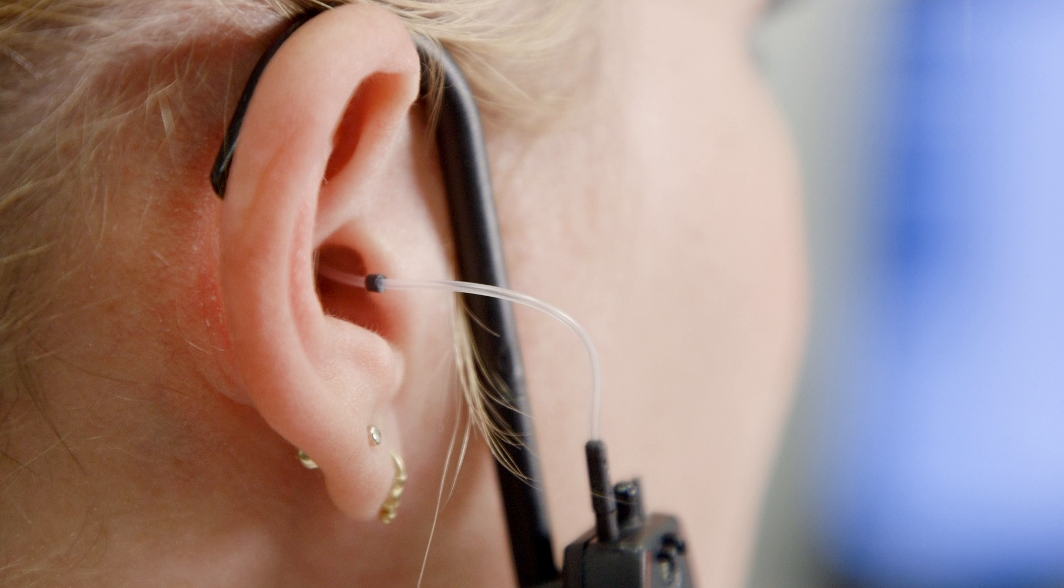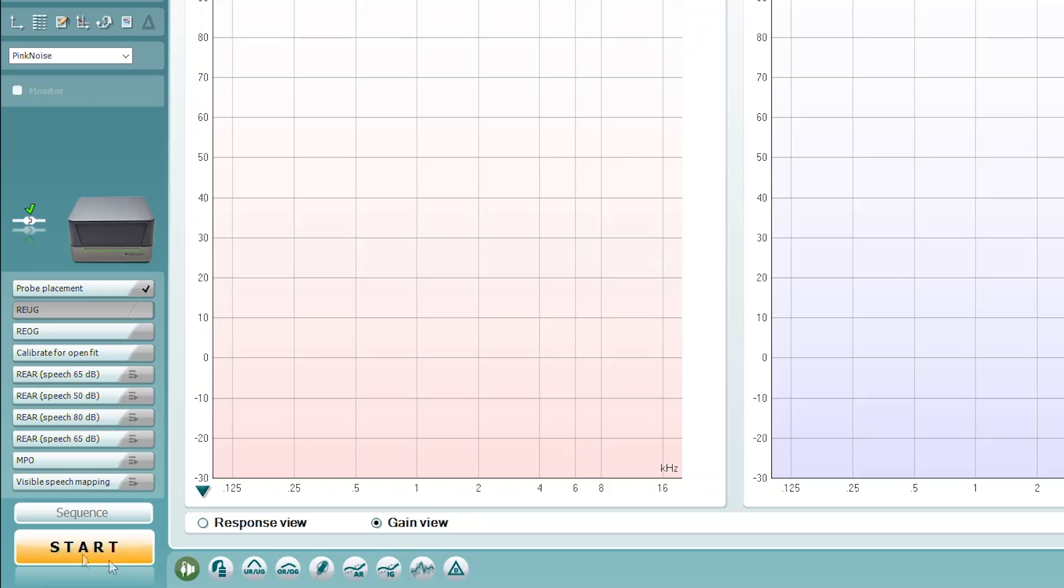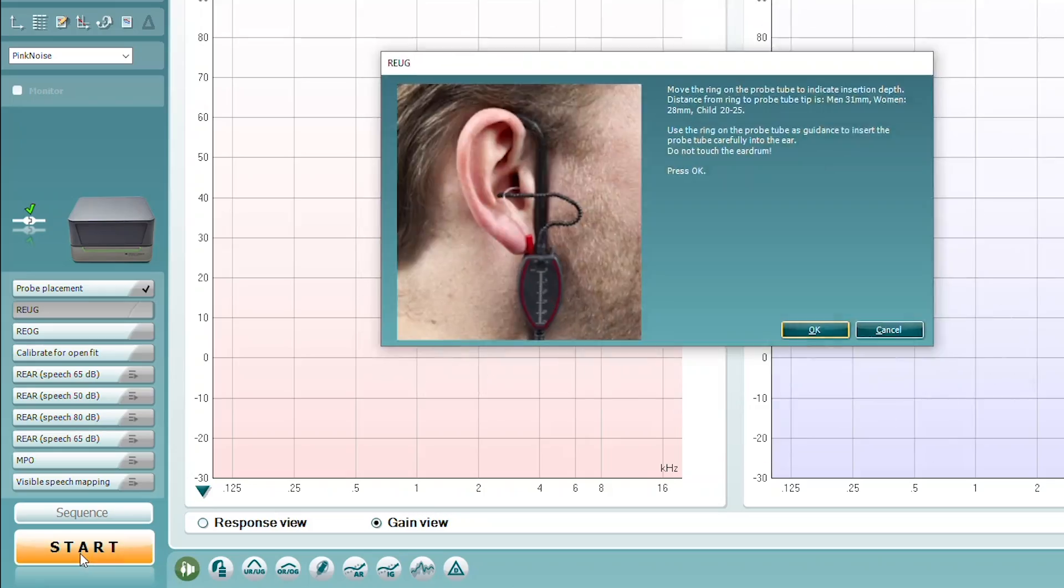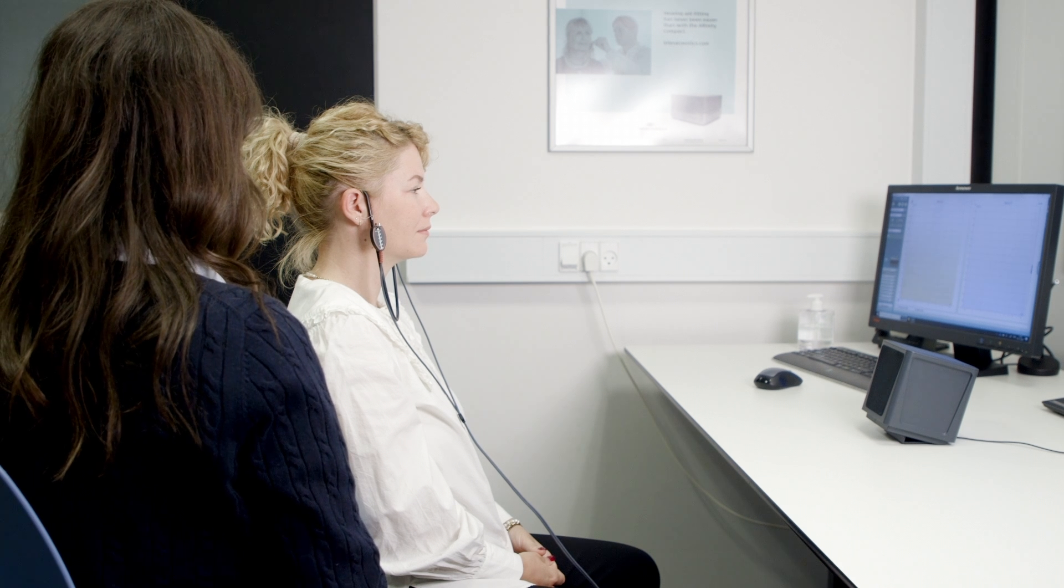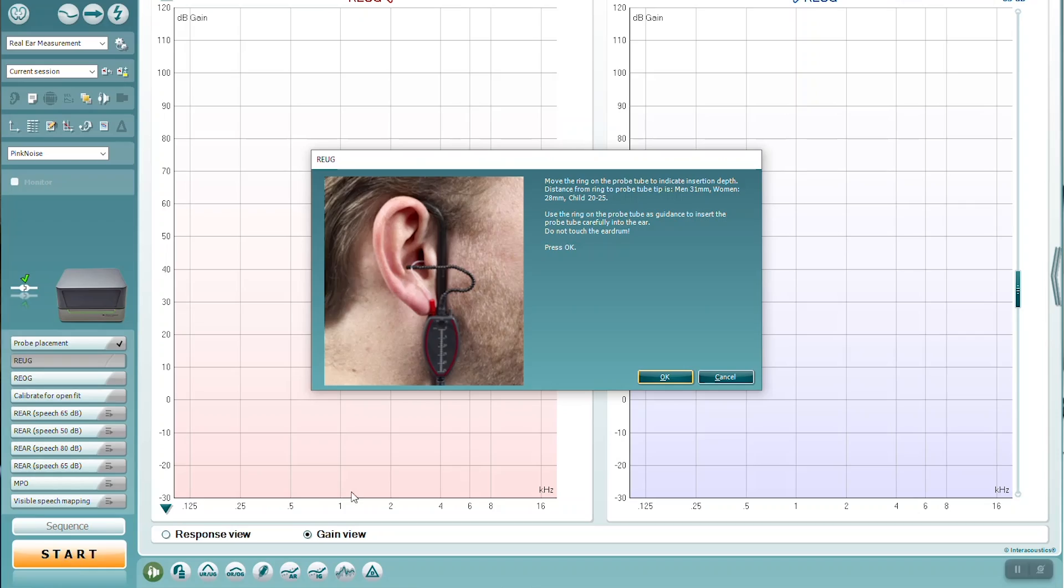When the probe tube is inserted, you can run the real ear unaided gain test to see whether the probe tube is at the correct depth. Place your client in front of the speaker with the REM equipment on and run the test.